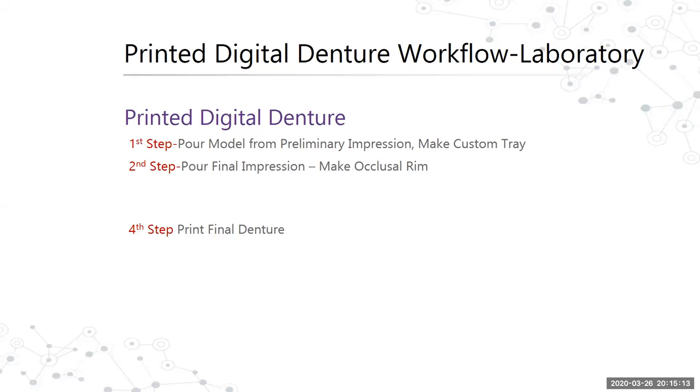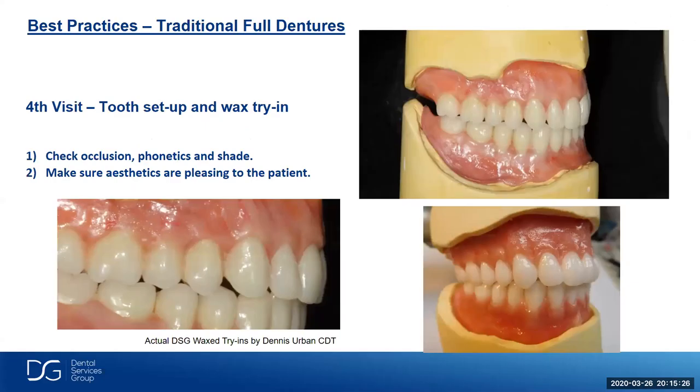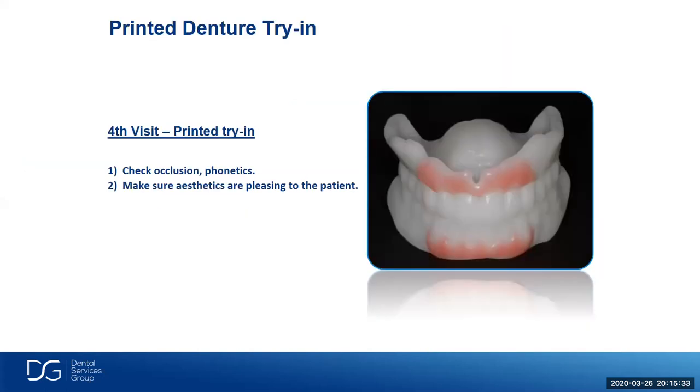Everything's the same, but that third step. On that third step, what we're going to do is scan the final impression or the model, plus we're going to scan the bite registration, design the case, and then print it for a try-in, and send you the printed try-in. So instead of getting a wax try-in with a tooth setup, you're going to be getting something like this in the dental office.